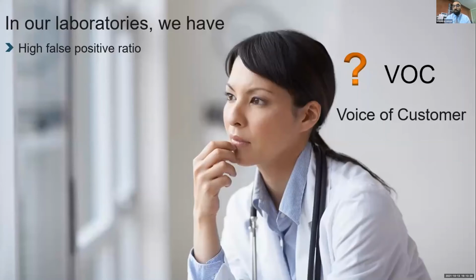How can these products give us more facilities or more options to easily report this kind of positive ratio, high positive samples? Also, as you know, some patients have NRBCs in the count. Normally, these NRBCs cause incorrect WBCs, giving you a high WBC count.